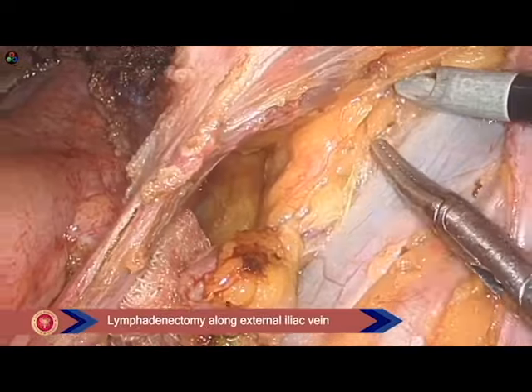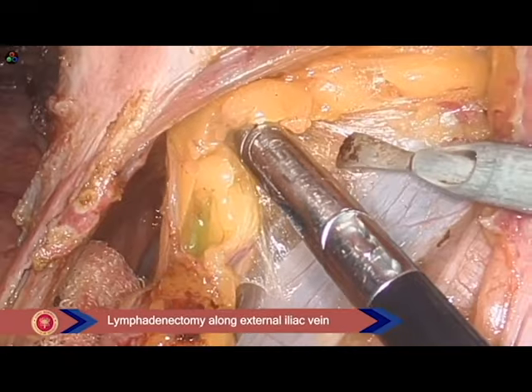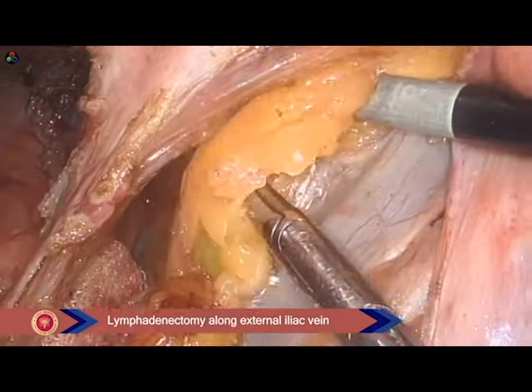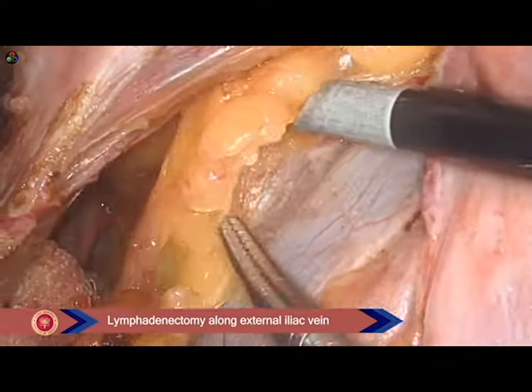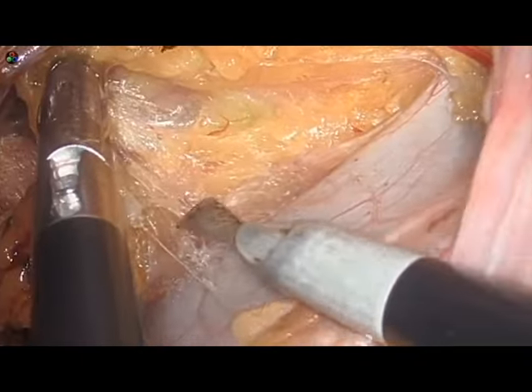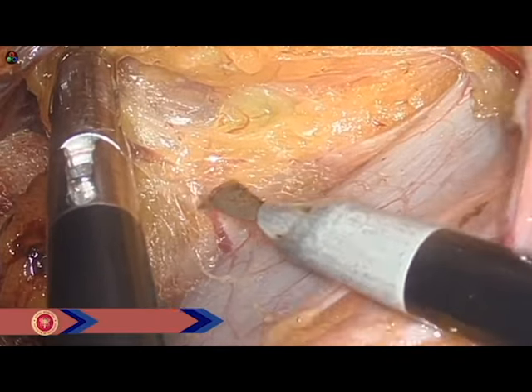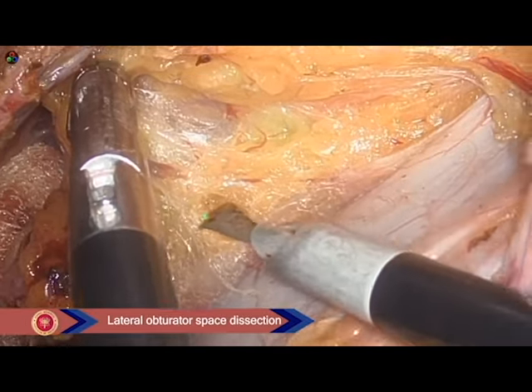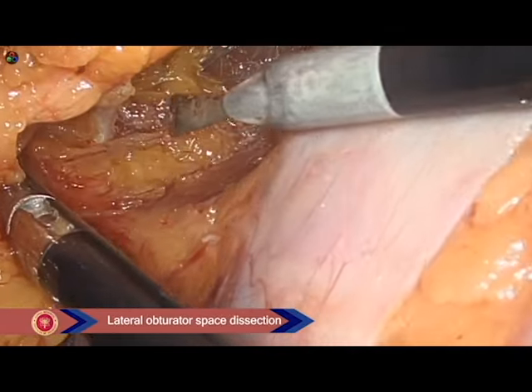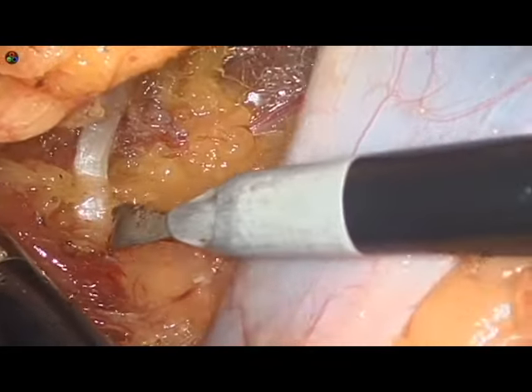The dissection then proceeds along the medial aspect of the external iliac vein. After the dissection of the external iliac vein, we can identify the internal obturator muscle. The distal part of the obturator nerve can be visualized.